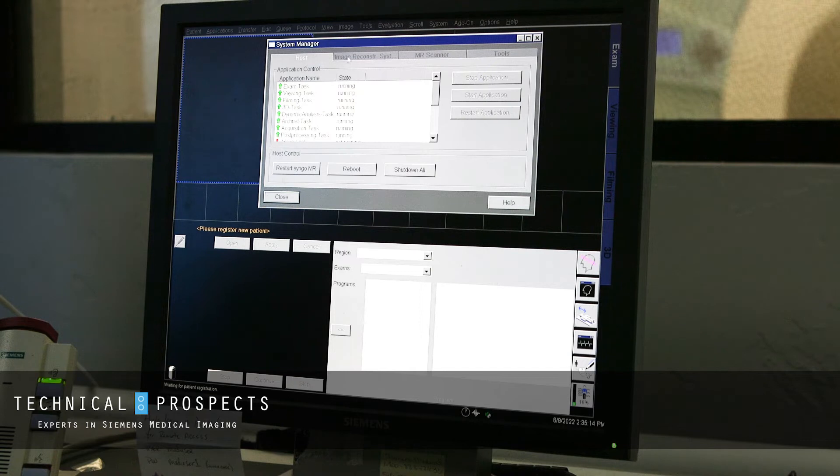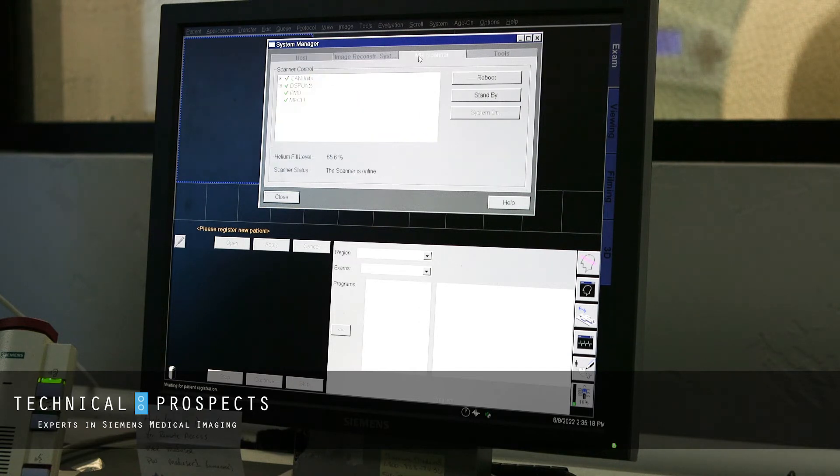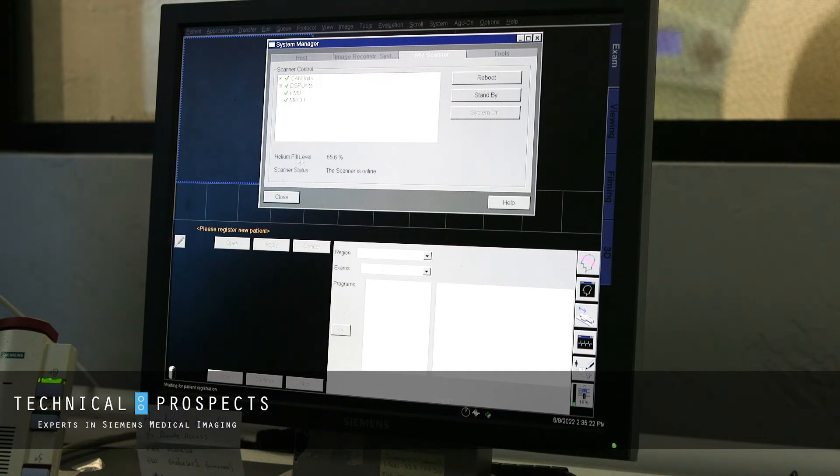You're going to have four little tabs at the top. You want to select MR scanner, the third tab over, and right here is your helium fill level.